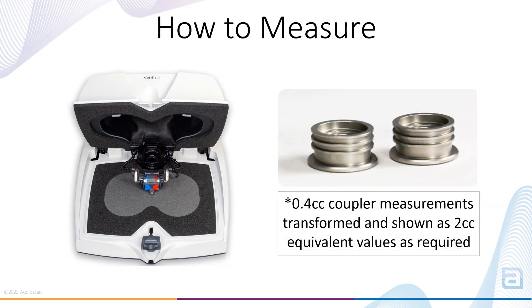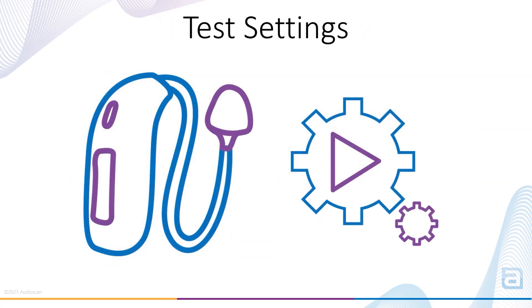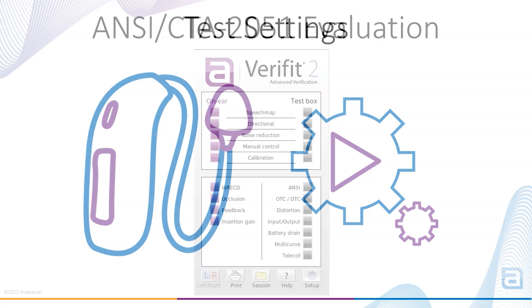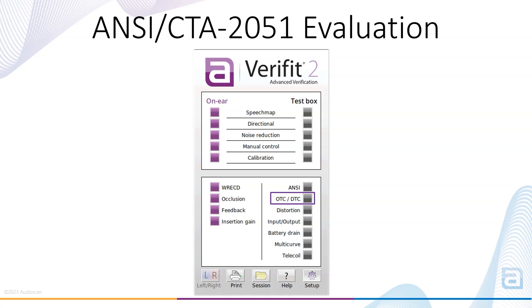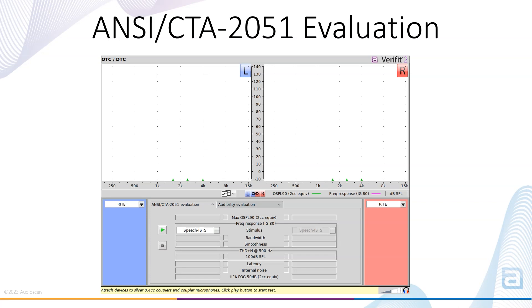Testing is performed in the binaural test box using 0.4 cc couplers, enabling efficient and accurate binaural testing of OTC and DTC devices. Measurements are automatically converted to 2 cc equivalent values as required by the test standard. Before running a test, if possible, set the OTC hearing aids to test mode or program the devices with full-on gain settings with the widest possible frequency range and non-linear adaptive processing minimized. To get started, select the OTC-DTC test suite from the Verifit 2 menu. With the ANSI/CTA-2051 evaluation tab selected, configure each device for left and right side, and configure the stimulus as speech or swept pure tones.